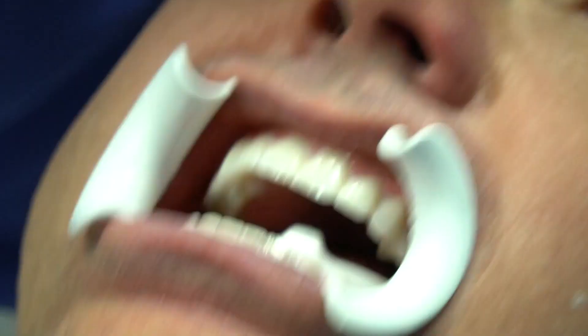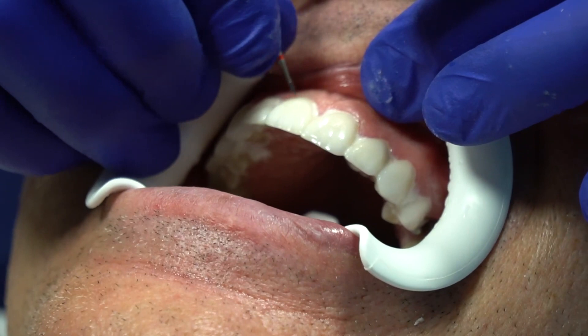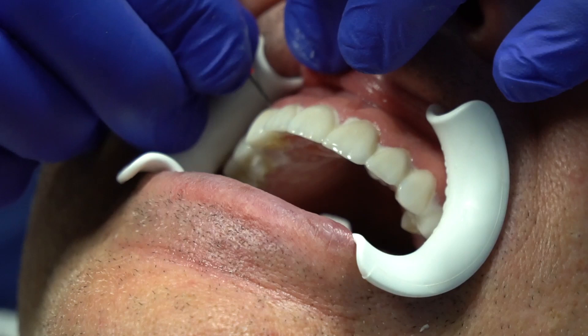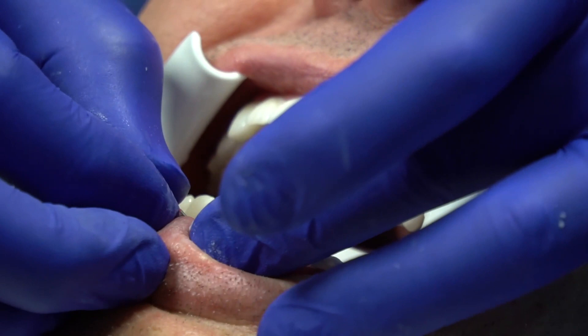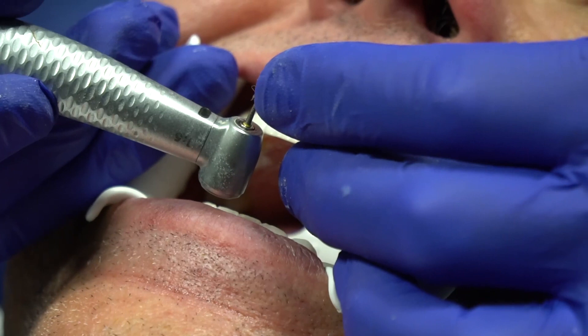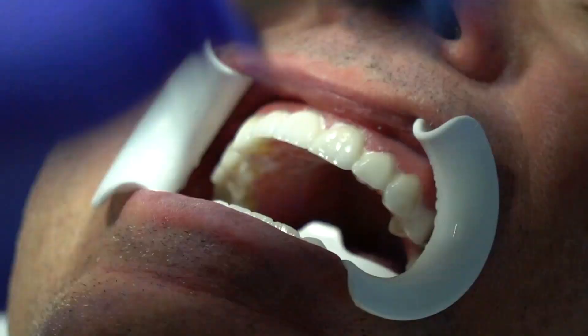There's a set of burrs I want to go through. The margins are almost finished — just a smidge of composite there. If I do the no-prep, there's probably more of a catch. The way you would finish a direct Class V composite is the way I want to do this. There are two finishing burrs: a long fine diamond and a carbide. The carbide doesn't cut on the end; the diamond does. The diamond's quicker, but you have to come back with the carbide. I'm going to switch to the carbide.